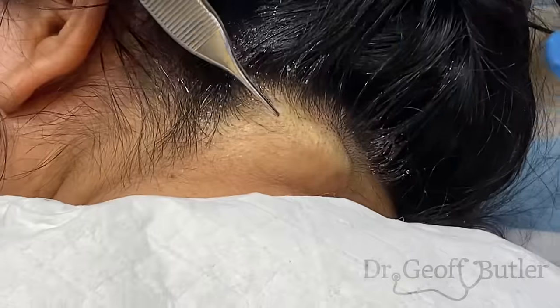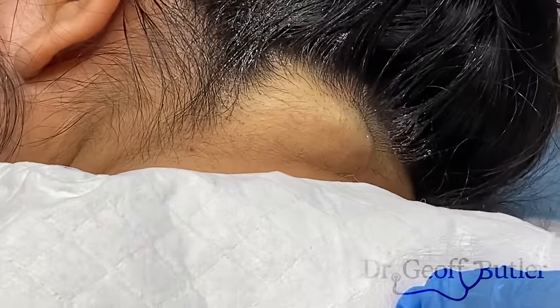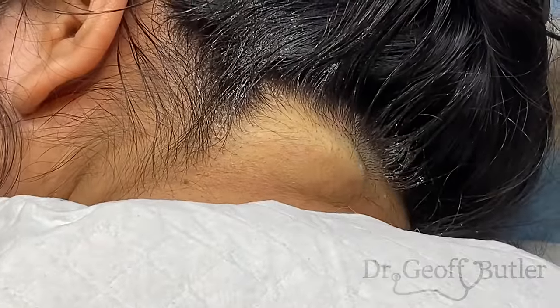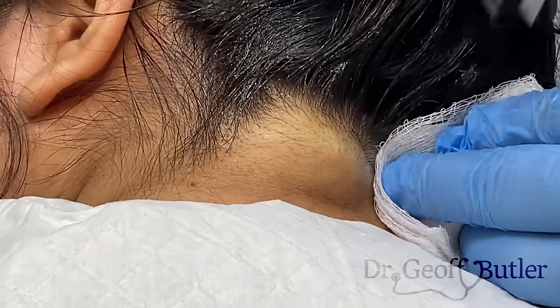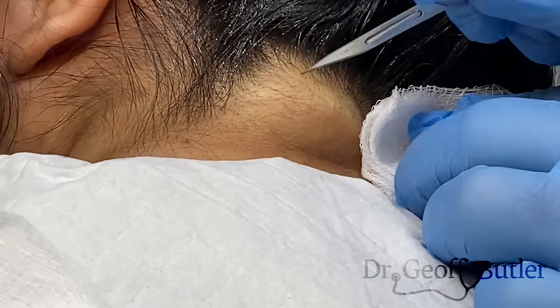The other thing that's hard in this particular area, the nape of the neck where you have all these baby hairs, we've clipped them, and from some suggestions actually from people online, we use gel now to pad that back down, but it is a hard area in and of itself. So this might get a little bit messy, but we're going to clean all of that up afterwards. We want to have a lot of 4x4s on hand, just take that there for me. So this is our number 11 blade.